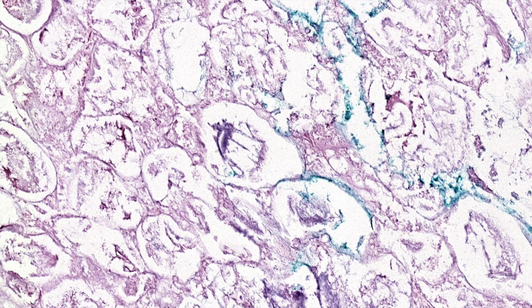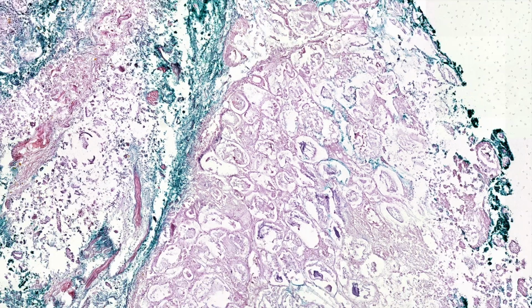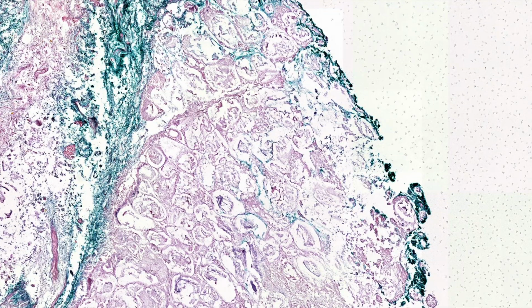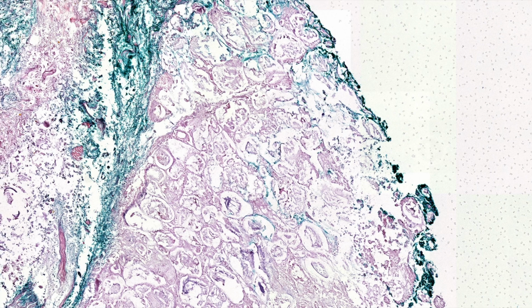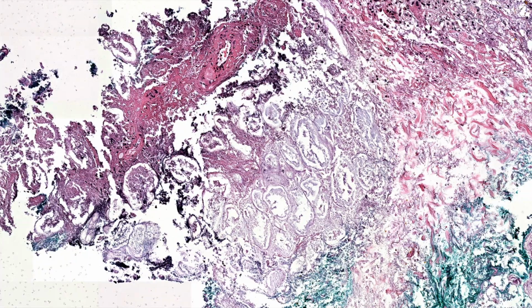That is the fat undergoes necrosis, and then it combines with calcium, and it basically makes soap. Like in the old days, soap was made by melting down tallow or lard, like animal fat, and mixing it with lye, I think sodium hydroxide. This is a similar kind of process where you're taking a mineral salt and mixing it with lipid, and it makes this kind of soapy substance. In fact, you can actually see this. It has a whitish yellow, firm look in fat that has been exposed, that has this type of change. And so, like you said, this is pancreatic panniculitis.